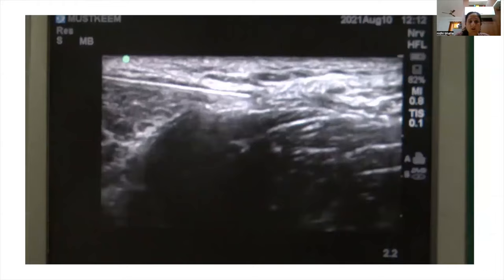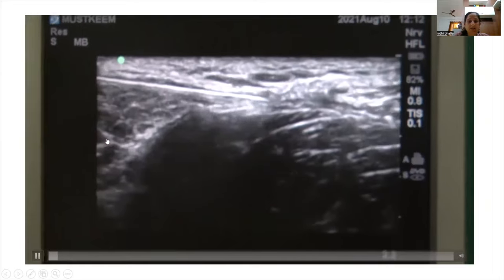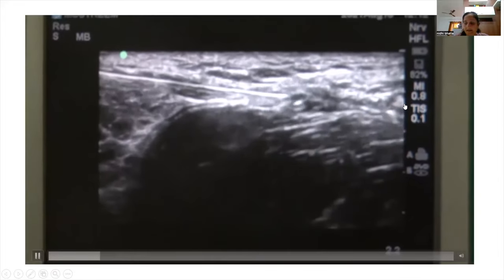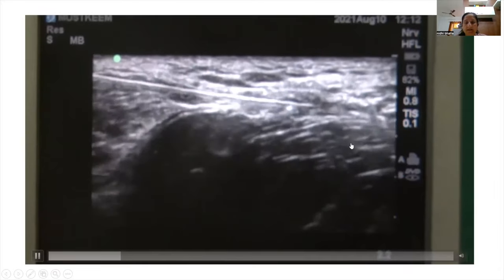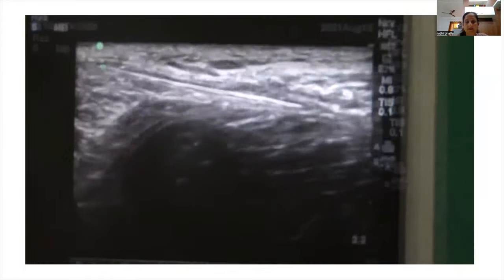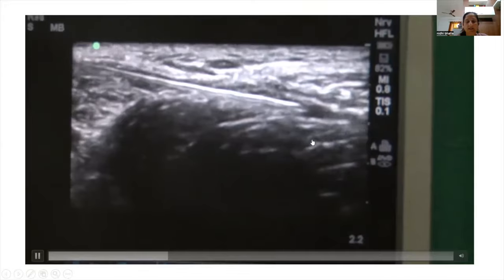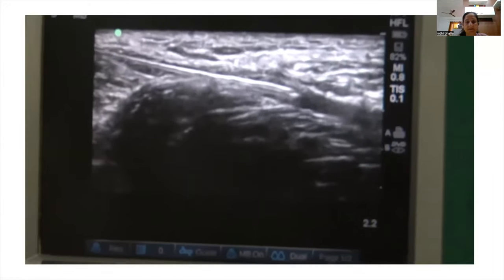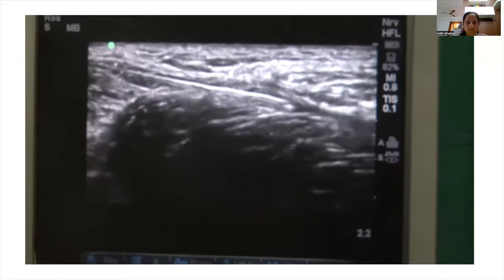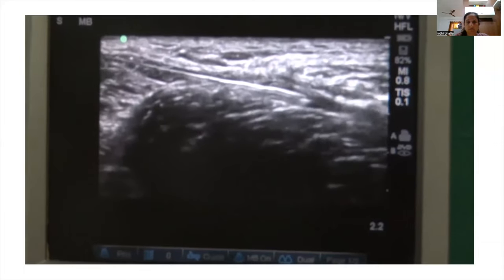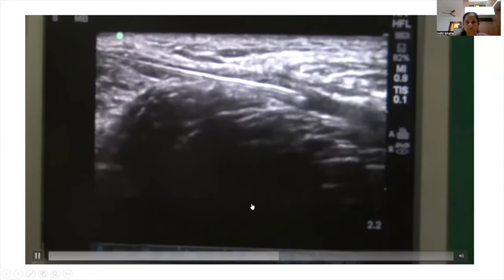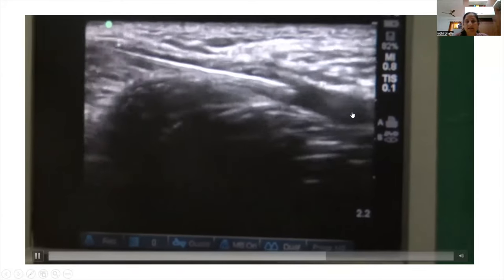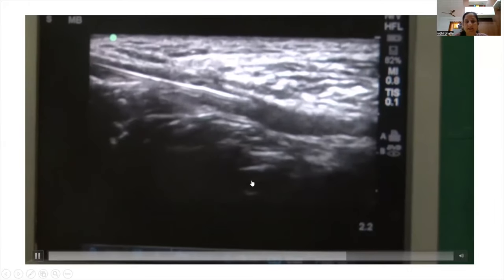In this video demonstrating the suprainguinal block technique, the needle enters from the foot end toward the head end. The deep circumflex iliac artery is identified, and the needle is advanced just below that arterial plane. You can see the 'unzipping' of the iliacus muscle as local anesthetic is deposited, creating a good potential space. The artery is lifted up and a nice spread of local anesthetic is visible just above the iliacus and below the artery.